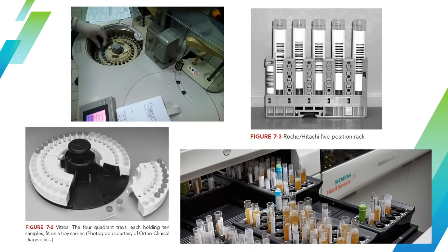So these are just some examples of your racks as mentioned. So this is your circular carousel. And actually, naa may designated numbers lang po na inyo makita. And then this is your rectangular racks. And this is how it looks like sa loading zone sa inyong auto analyzers.